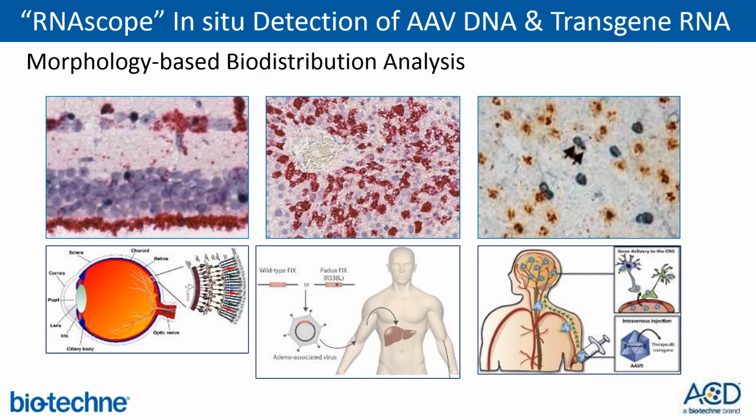These assays provide us with a means of visual assessment on a single cell level in intact tissue of both vector copy DNA, as well as the transgene expression from those vectors.